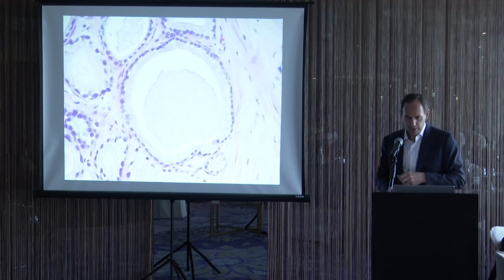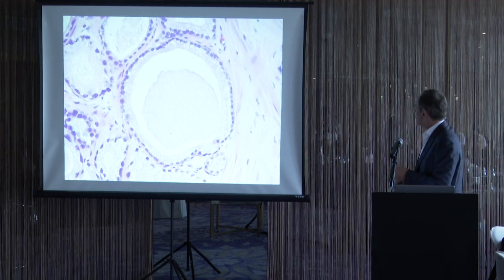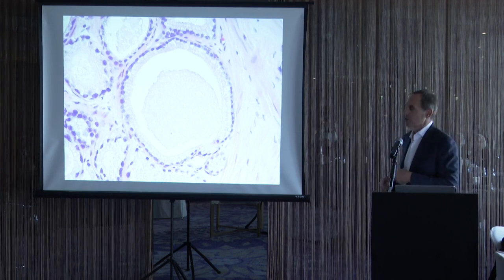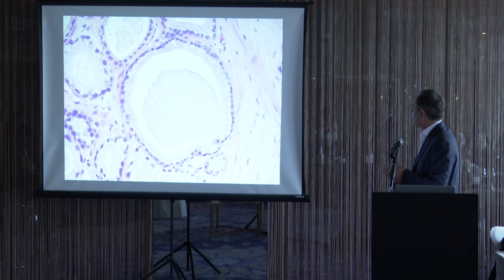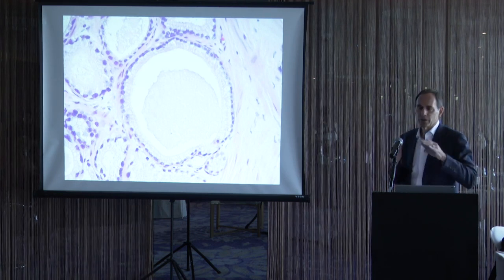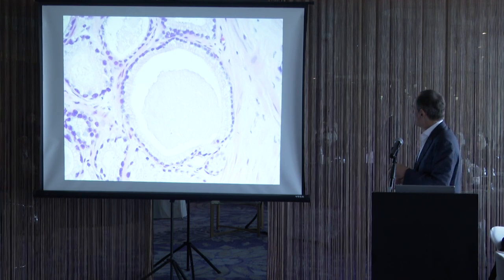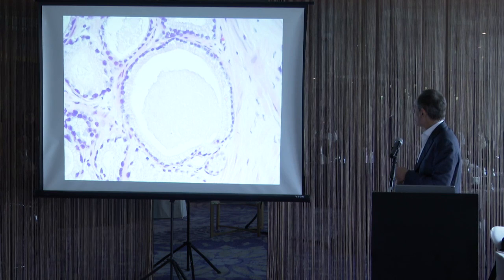So then we go to a little higher magnification. This gland has, again, mixed features. It's a large gland, which we tend to associate with a benign prostate gland. But most large benign prostate glands have a lot of luminal infolding or ruffling of the luminal border. This one has a very sharp, straight, razor-edge border. That favors cancer.